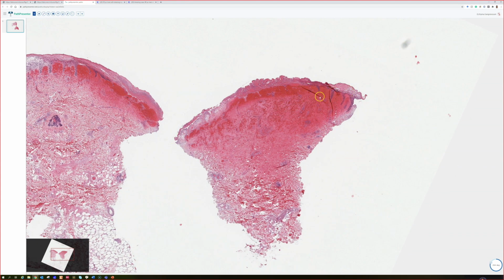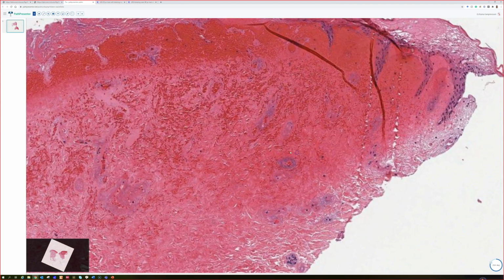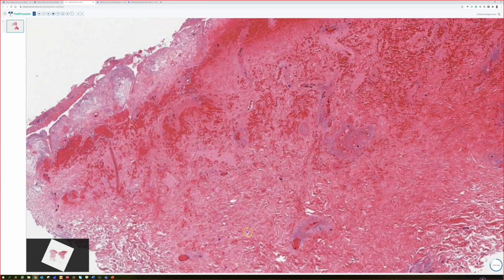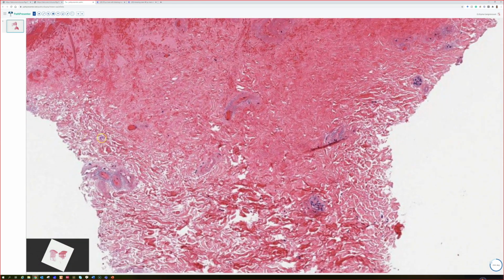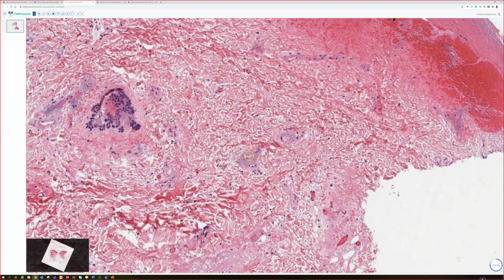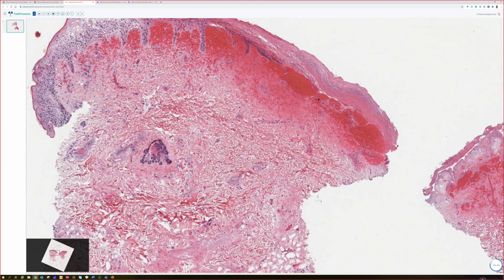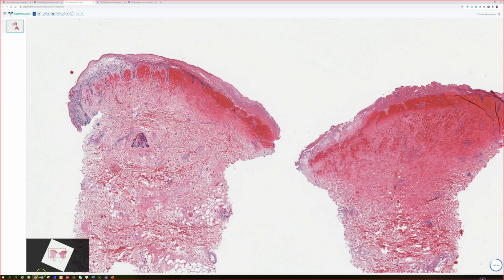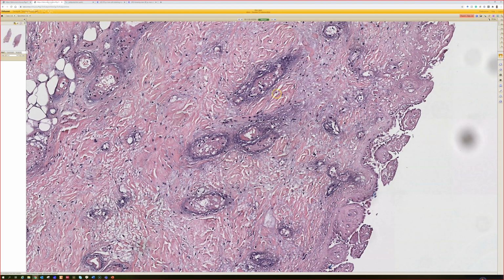The epidermis is sloughing away. Tons of hemorrhage in this case here. Looking at the vessels, exactly like what we're seeing in our case, right? Blue haze. So that's the finding that you really want to look for, is that bluish, hazy material around the vessels with the necrosis and, of course, the proper clinical setting. Ecthyma gangrenosum from Pseudomonas aeruginosa. Good work.